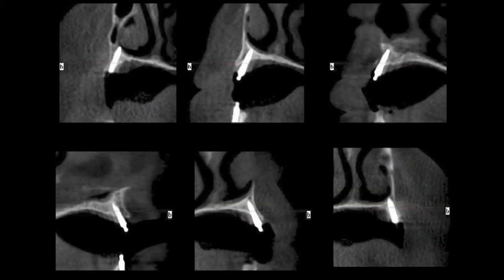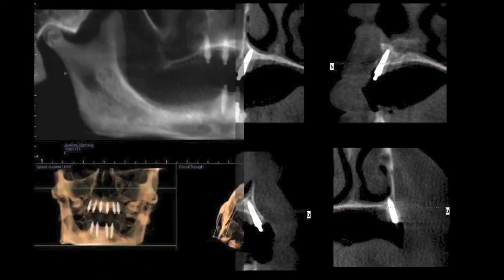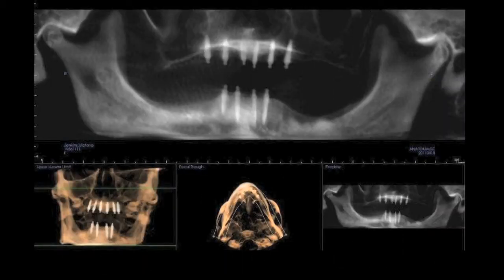A post-operative CT scan was taken. The cross-sectional slices demonstrate the implants in almost the exact proposed positions and have taken advantage of all the available bone while keeping the mini implants as parallel as possible. This case would have been multiple degrees more difficult for any clinician without the use of a digitally milled surgical guide.